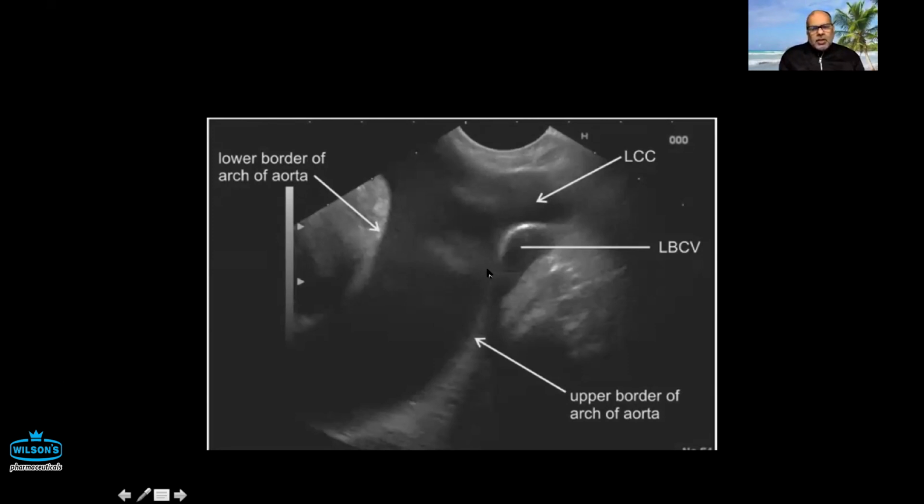As you see, we are seeing upper and lower here, but on the image it is probably looking upper and lower. So that's what I'm saying: you have to keep in mind how the anatomy orients itself on the EUS.